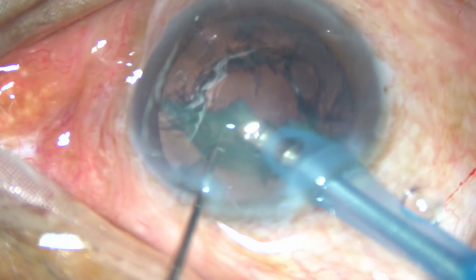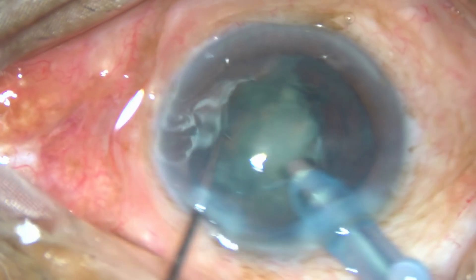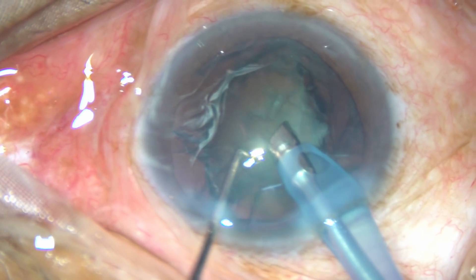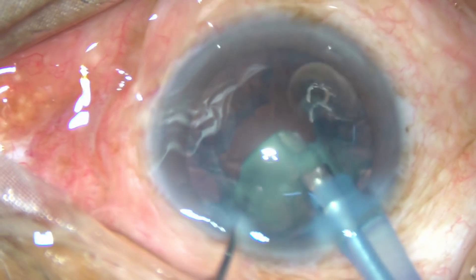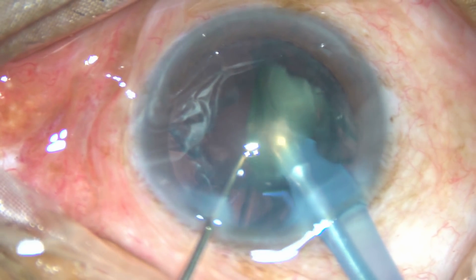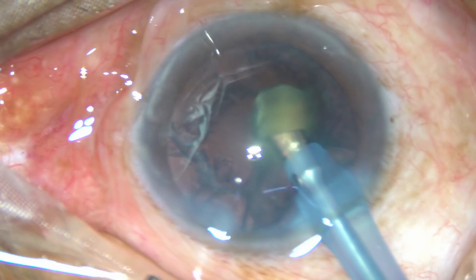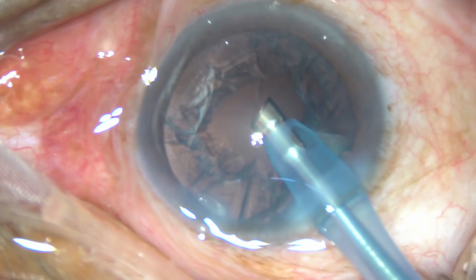Now try to rotate the other hemi-nucleus and you find that it is mobile now. Hydrodissection is occurring as you are emulsifying small pieces of nucleus. No hydro phaco doesn't mean hydrodissection has not occurred — it is occurring simultaneously, almost.